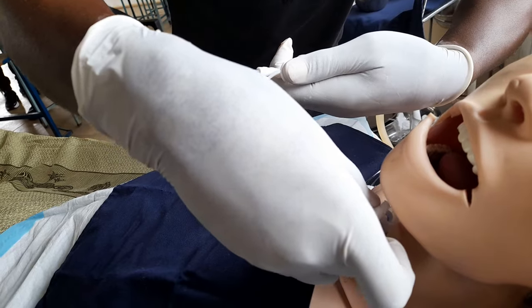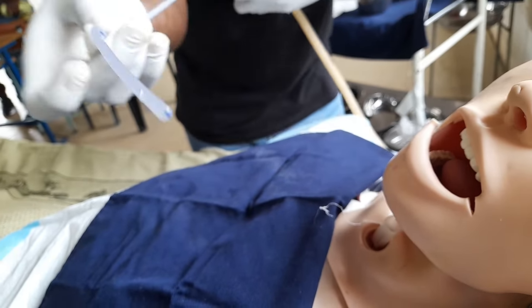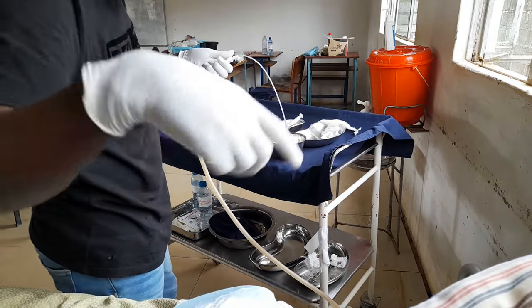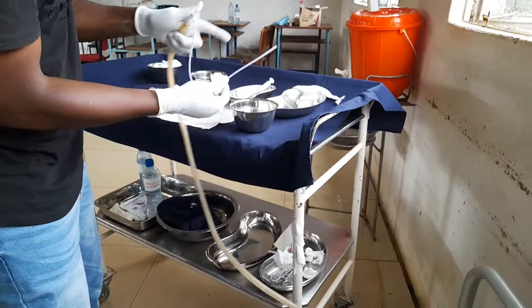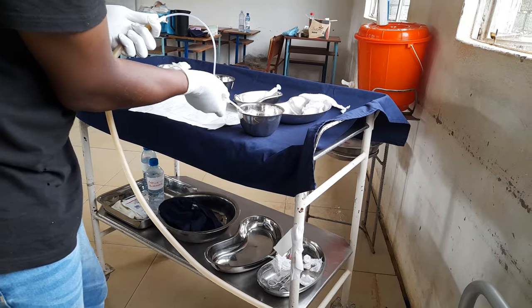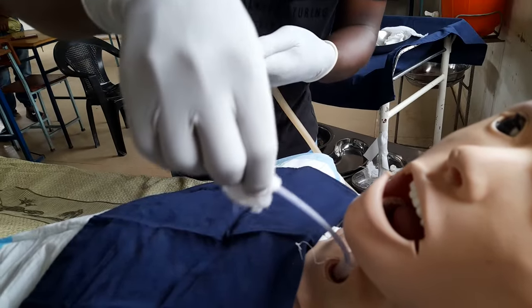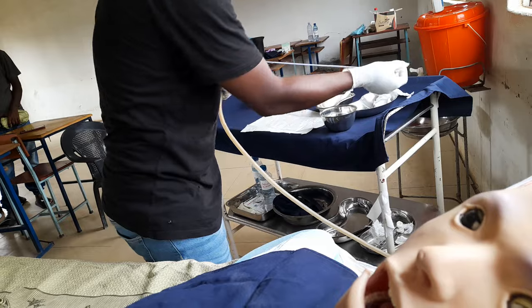Once the catheter reaches the correct depth, occlude the thumb port and withdraw in a circular motion — this is when suctioning occurs. Move it out, then clean the catheter with normal saline and drop it into the normal saline pot. The catheter will show mucus since it went inside. Get another catheter and repeat: insert to 15 to 20 cm, occlude to push mucus out, then push in again quickly, occlude, and suction in a circular motion. Once done, clean the catheter with normal saline.